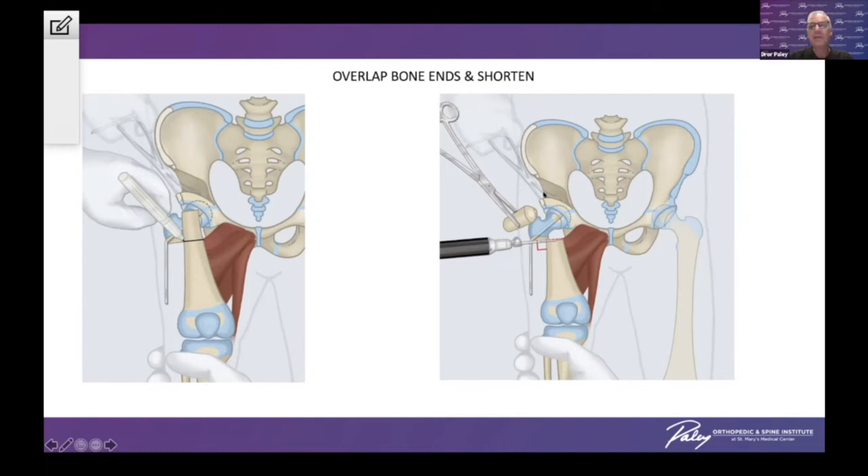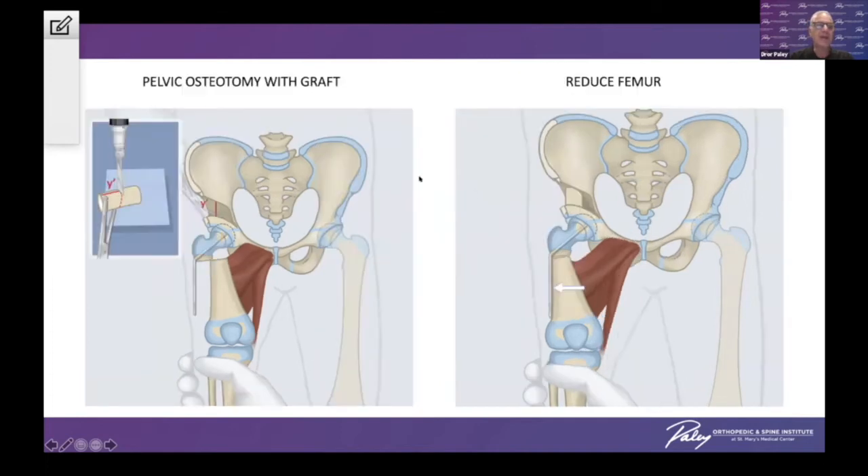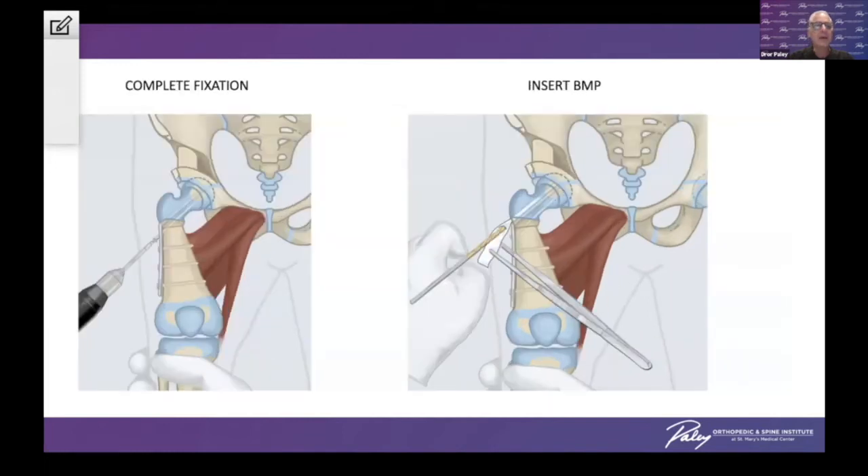You can see we've already performed an iliac osteotomy — a Dega-type osteotomy. With this opening wedge, we use the bone graft from the shortening to support that opening wedge. We complete the fixation with our screws, and then in these non-ossified necks, the only way I've found to get them ossified is to insert bone morphogenic protein (BMP) into the femoral neck. Without the BMP in these non-ossified necks, they frequently do not ossify.